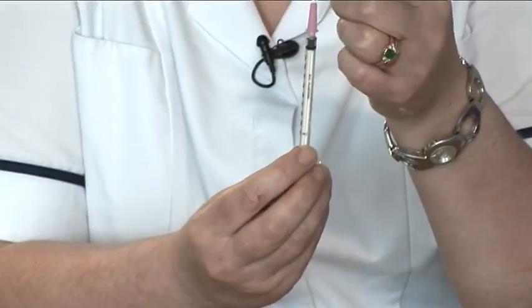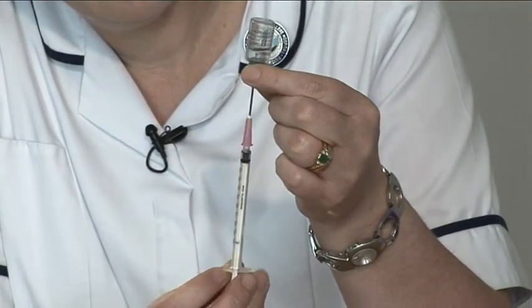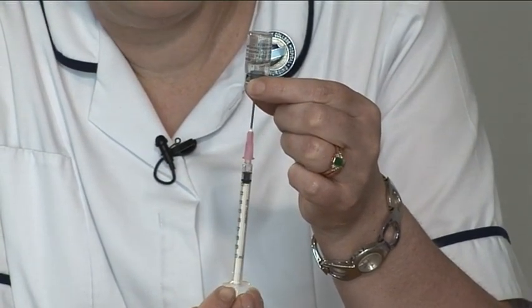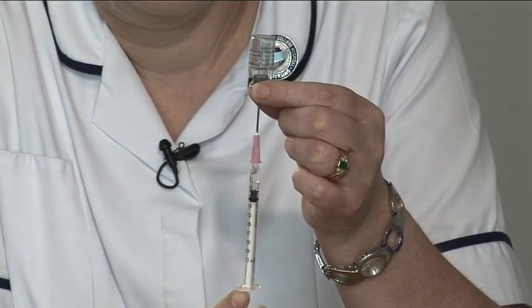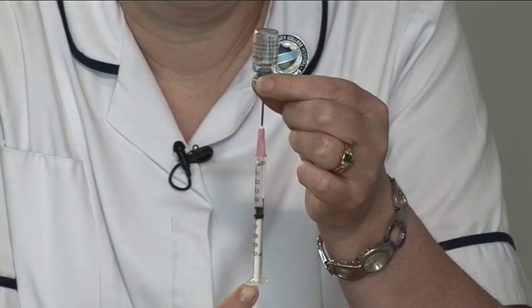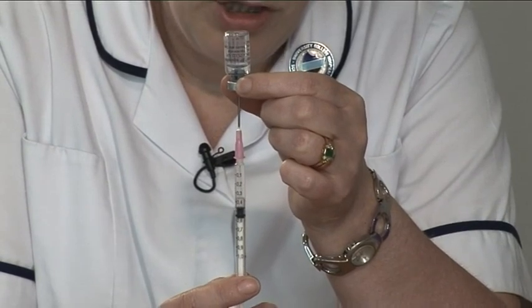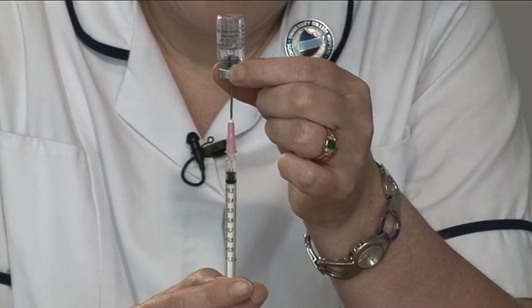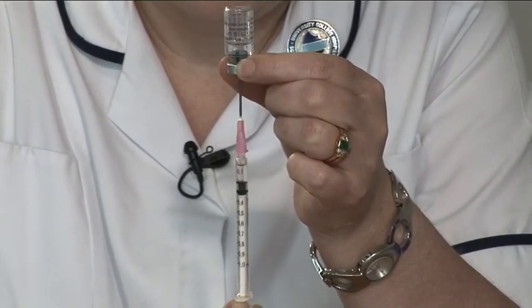Turn both the needle and syringe upside down and, making sure that the needle is in the diluent, slowly now pull the plunger of the syringe out and suck back all the liquid. If you find you've got a big air bubble in the syringe, push the plunger back up again and then pull it out.